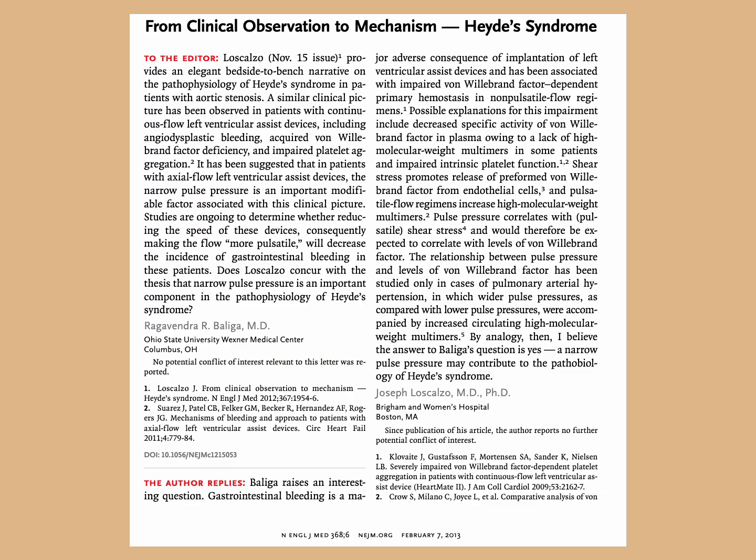And there were studies ongoing to determine whether changing the speed of these devices, consequently making the flow more pulsatile, will decrease the incidence of GI bleeding in such patients.